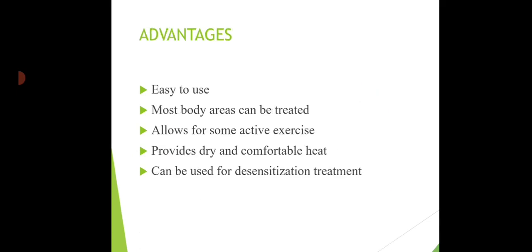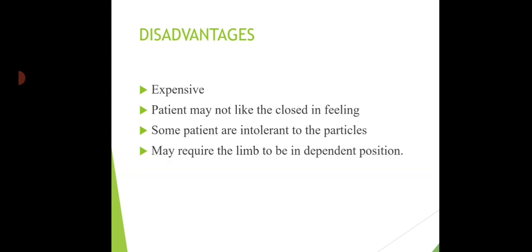Advantages of fluidotherapy: it is very easy to use, most body areas can be treated, it allows the therapist to perform some active exercises during the treatment, it also provides dry and comfortable heat, and can be used for desensitization treatments. Disadvantages are that the unit is very expensive, the patient may not like the closed feeling when the limb is inserted, and some patients are intolerant to the particles.